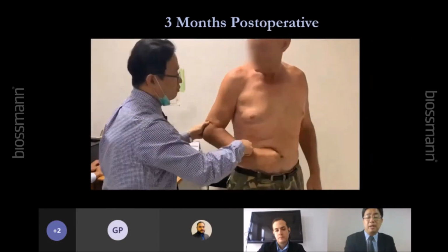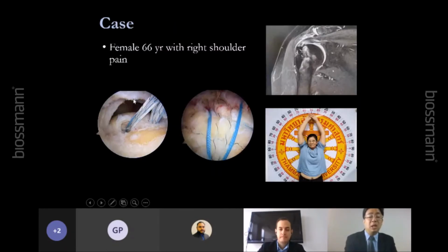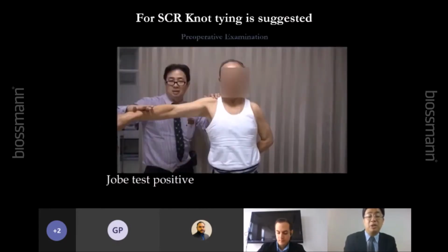Infraspinatus and supraspinatus. And this is the MRI after surgery. There is good healing of the infraspinatus and the supraspinatus. So we collected the patients, and they have very good results. Comparing our knotless and knot tying techniques, we found that the patients have better quality of the rotator cuff using the Sugaya classification.